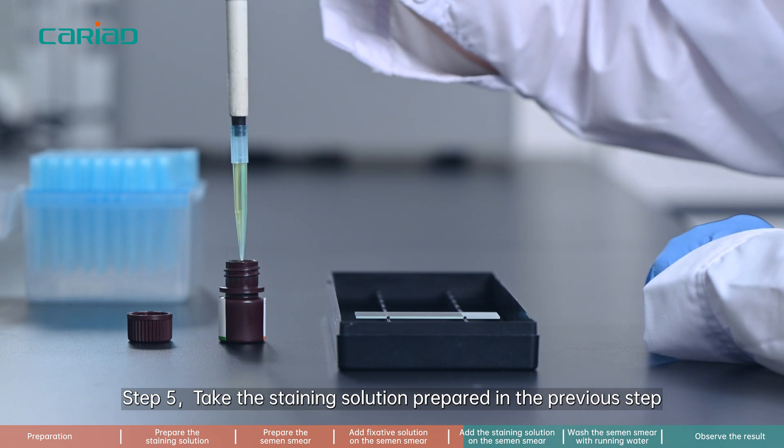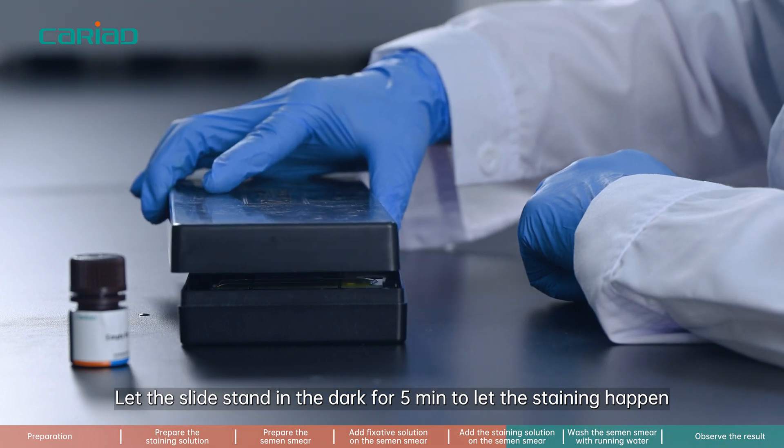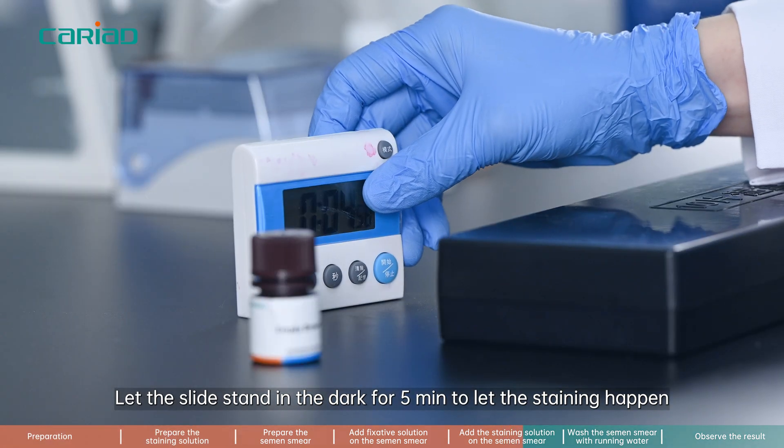Step 5. Take the staining solution prepared in the previous step and add it on the slide, covering it as much as possible. Let the slide stand in the dark for 5 minutes to let the staining happen.